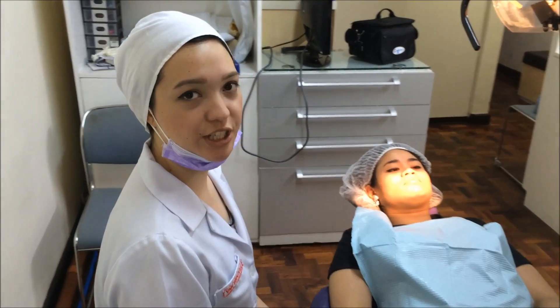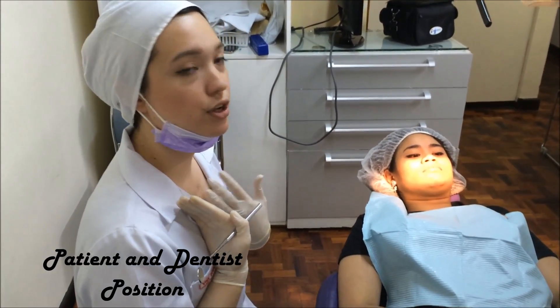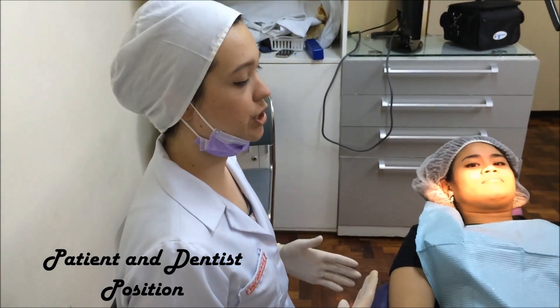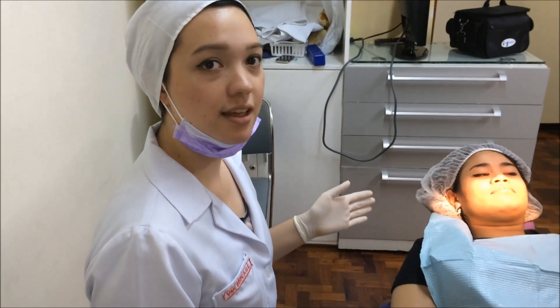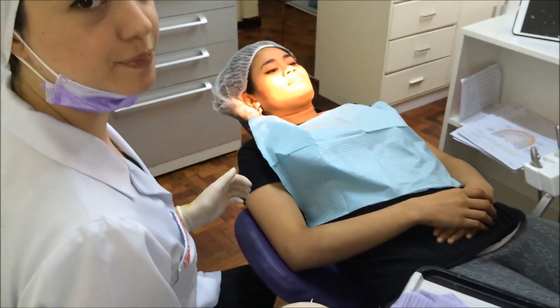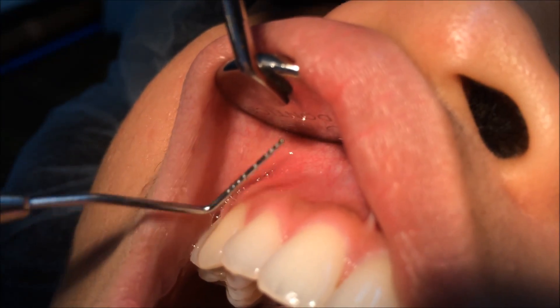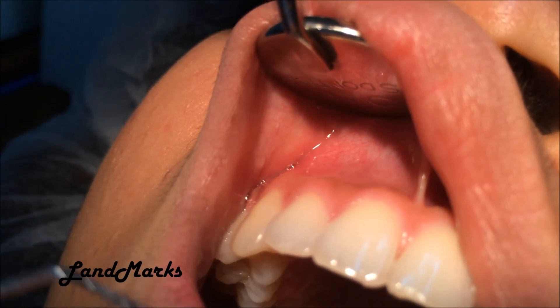We are about to demonstrate the proper positioning of the patient and the dentist. The dentist is at the 8 o'clock position, which is appropriate for the supraperiosteal technique being demonstrated. The patient is in a supine position. We will now show the area of insertion, the target area, and the landmarks of the supraperiosteal technique.